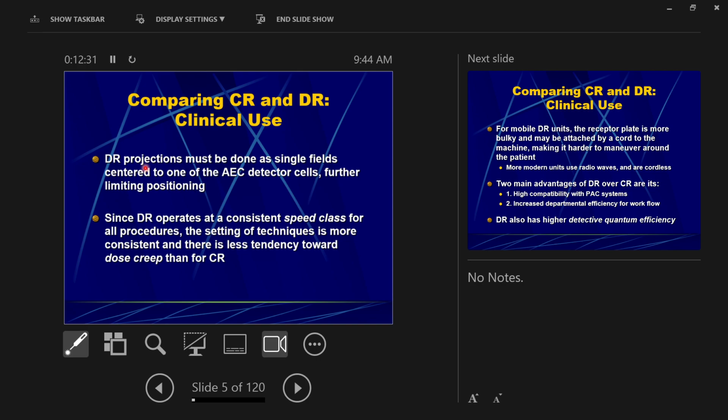Both of these, there's no direct connection to the computer, right? There's no battery pack, no Wi-Fi connection, right? So both of these, you can take multiple images on here, right? Multiple different images in different positions, just in different spots on the piece of film. Like a collage? Kind of, yeah. If you want to think about it, I think that's an okay way to think about it. And display all of them at one time, on the screen or on the view box at one time.